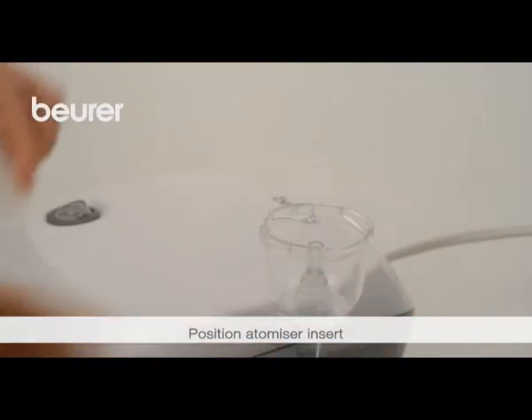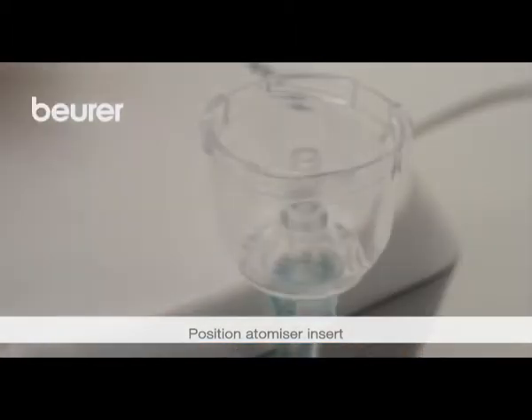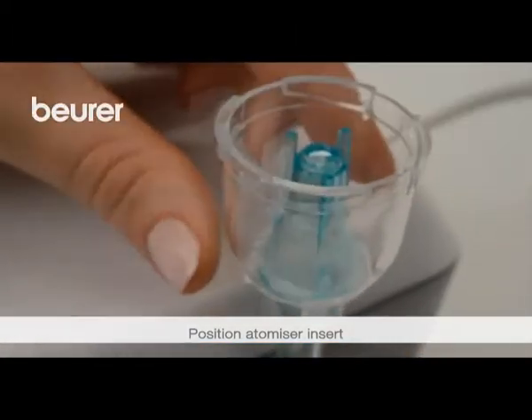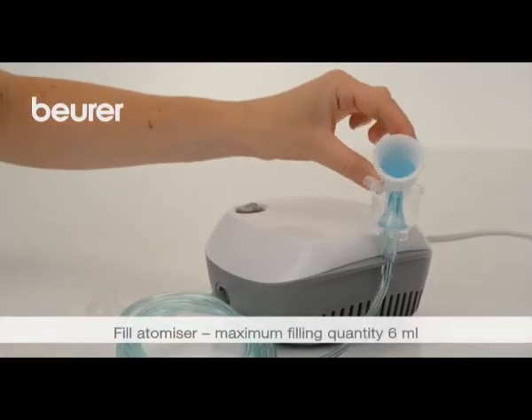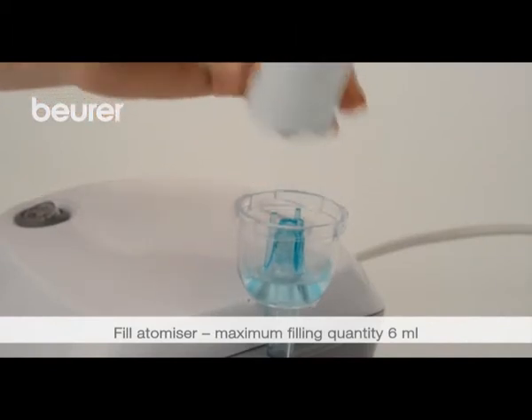Open the atomizer. Screw the top of the medication container. Place the atomizer insert in the medication container.